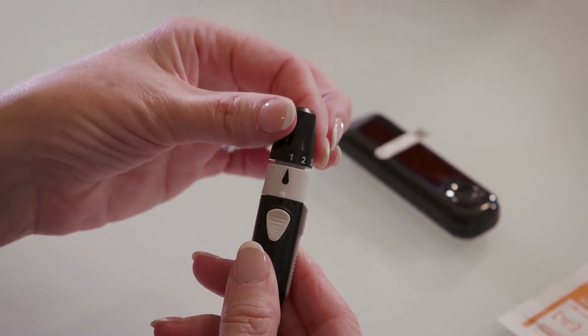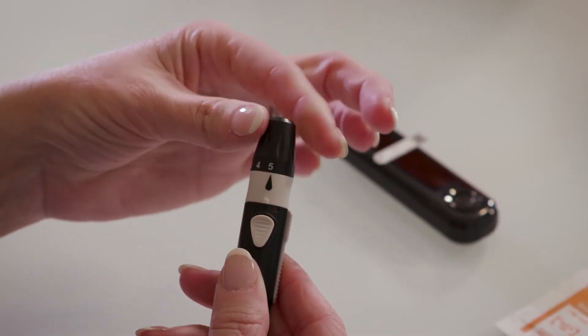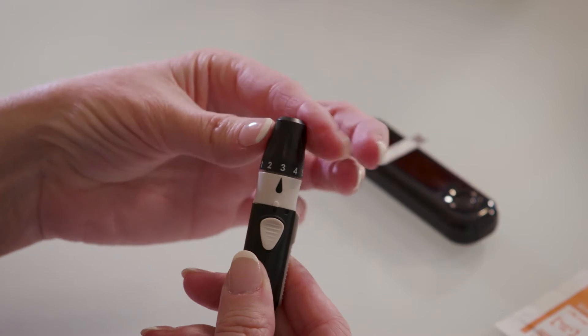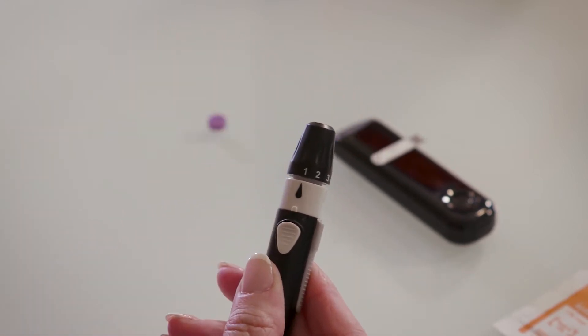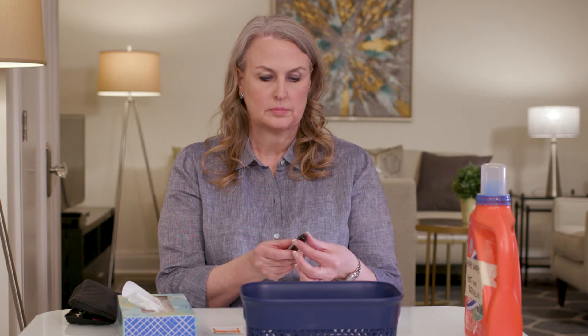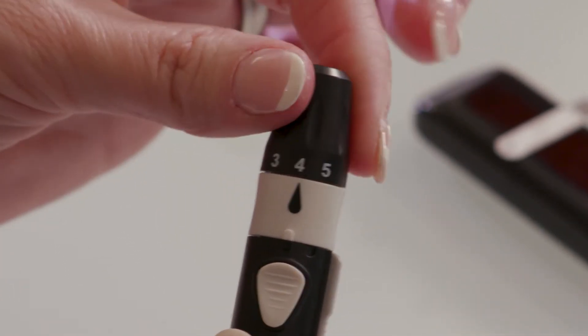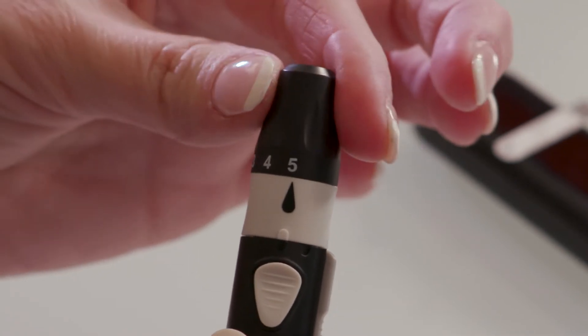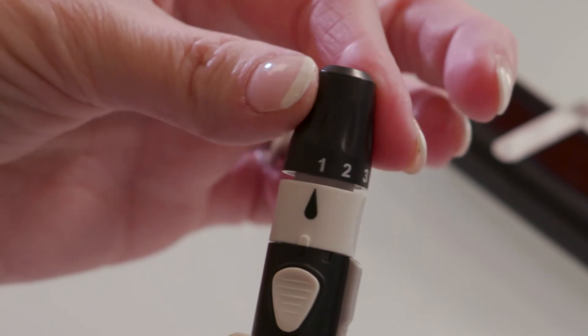Set the lancet puncture depth by turning the black dial with numbers at the top of the end cap. This controls how deep the lancet will go into your skin. It's best to start with a level one or two and increase the depth as needed. The dial can twist easily, so make sure it's set to the right level every time you use the lancing device.